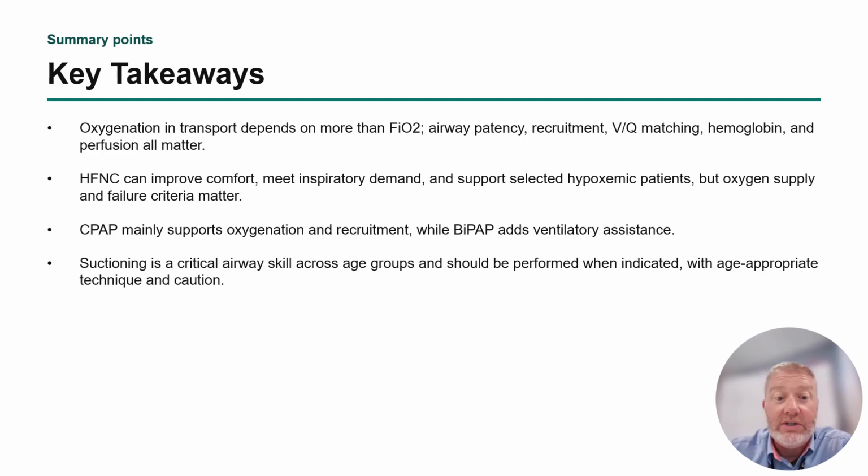CPAP mainly supports oxygenation and alveolar recruitment, while BiPAP adds ventilatory assistance from the pressure support that is given when you set both the IPAP and the EPAP. And then suctioning is a critical airway skill across all age groups and should be performed only when indicated, with age-appropriate technique and with caution. And we'll probably do those things in lab, I would think.